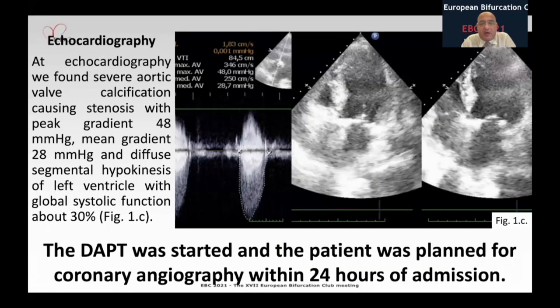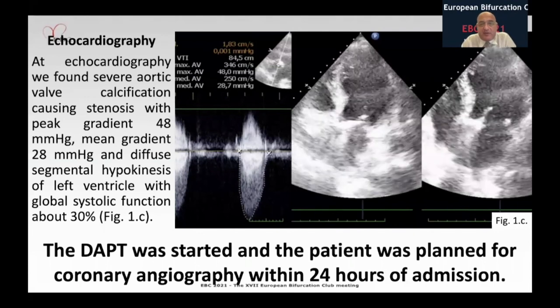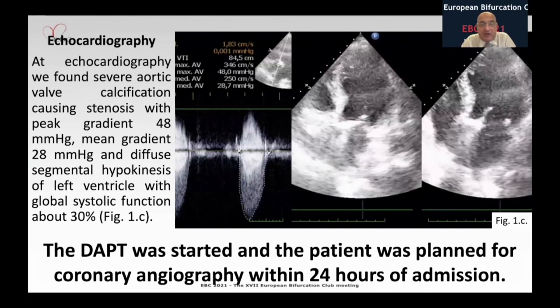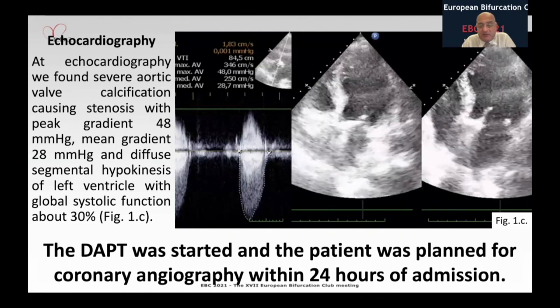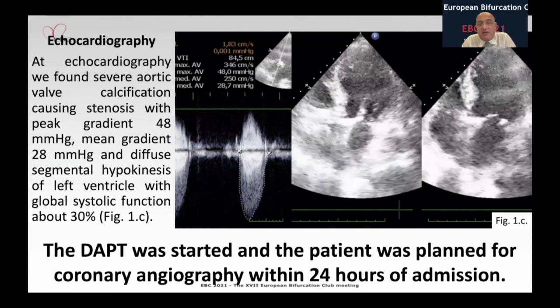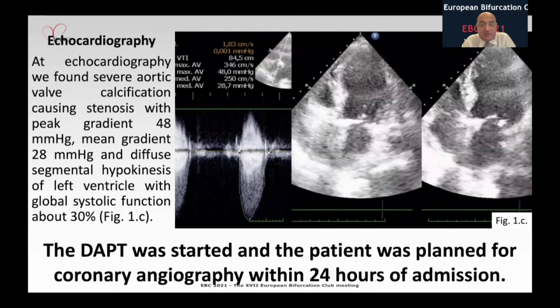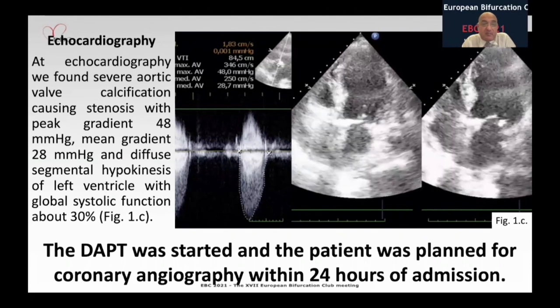The patient was prepared with DAPT treatment and for angiography the next day. By the way, her echocardiography demonstrated a severe calcific lesion with stenosis of the aortic valve and an ejection fraction of something about 30%, so a really difficult patient.